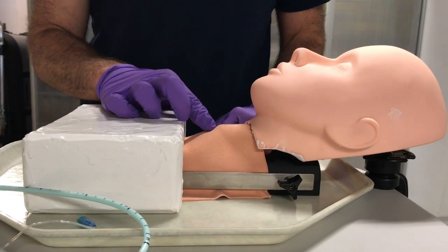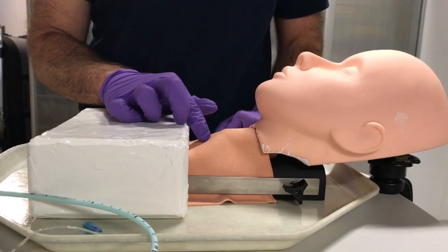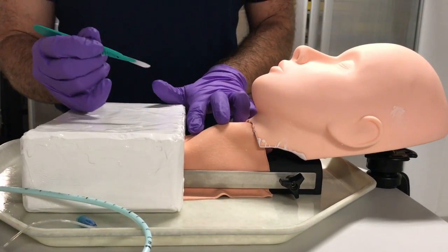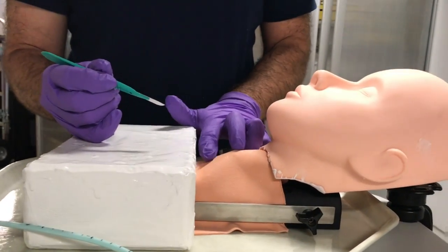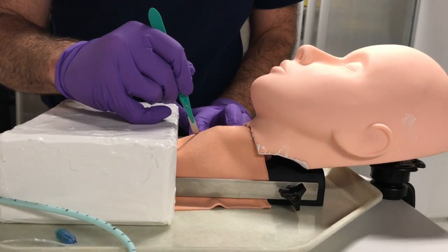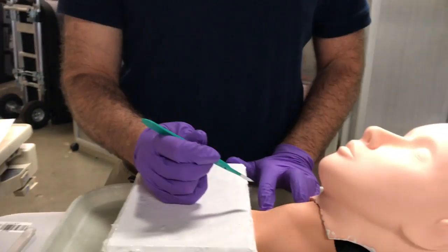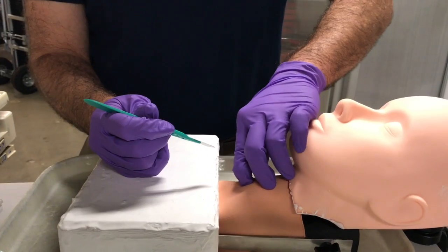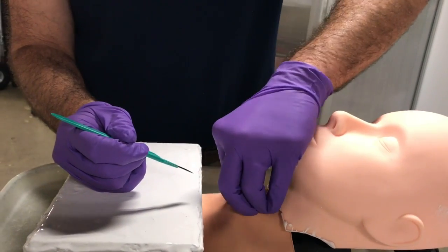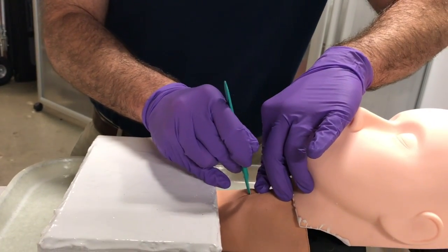Once you've identified your landmarks and identified the cricothyroid membrane between the thyroid cartilage and the cricoid cartilage, you make your incision. I recommend making a vertical incision over the membrane between the thyroid and the cricoid cartilage, through the skin and some of the soft tissue. This incision is good because it allows you to extend upwards or downwards if needed. Once you have your skin incision, you can blunt dissect with your finger down to the cricothyroid membrane and make a horizontal incision across the cricothyroid membrane.